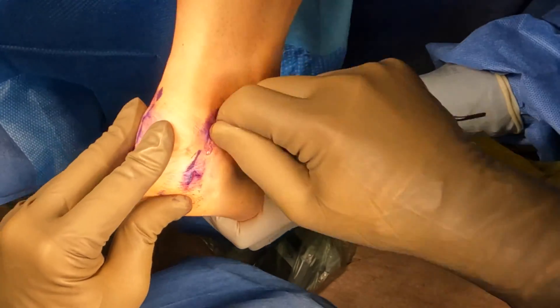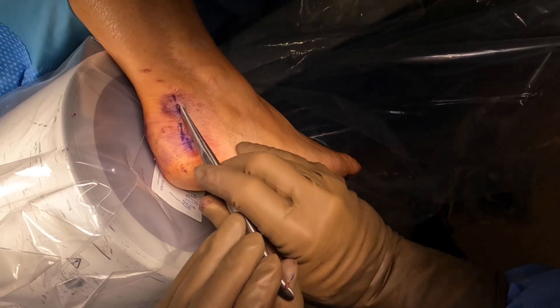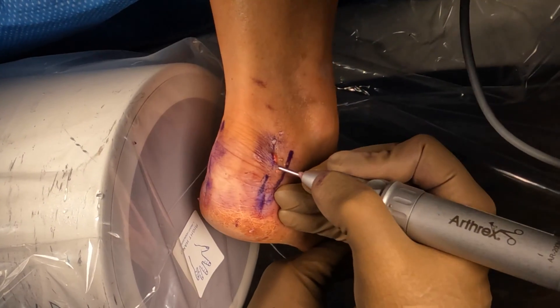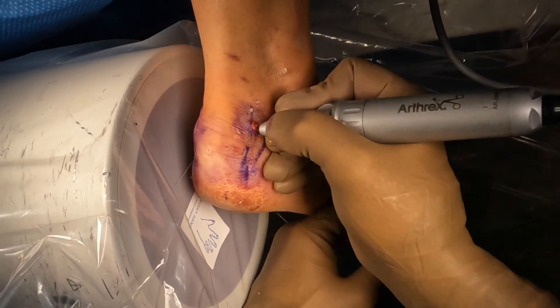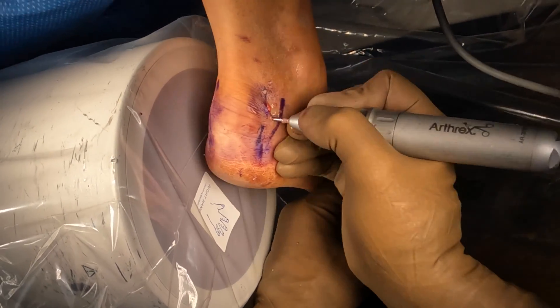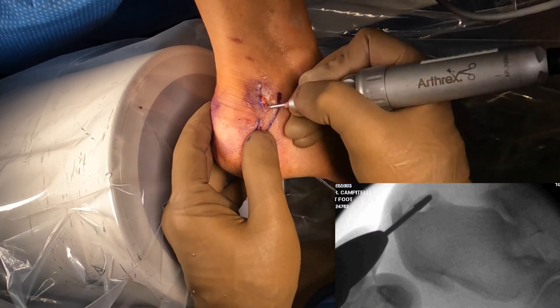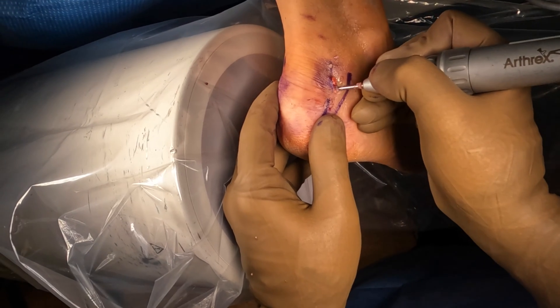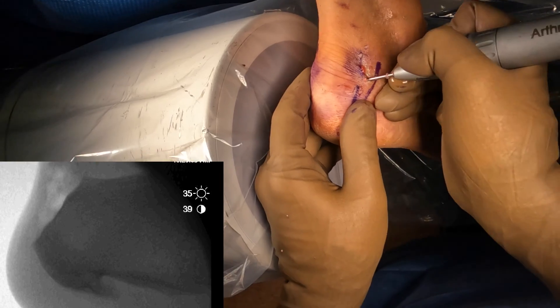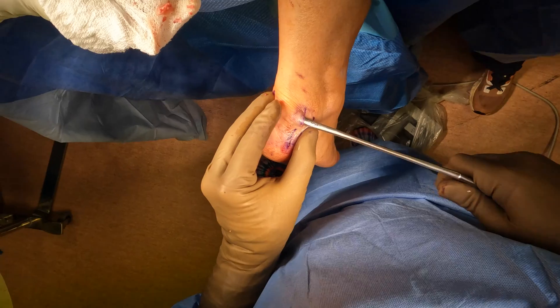What you can see we're doing here is separating the Achilles tendon from the calcifications that are on the back of the heel. We're using intraoperative fluoroscopy, which is x-ray, to allow us to see this bump so we know exactly where we're working. The analogy would be something like doing arthroscopic surgery in the knee or ankle, or even laparoscopic surgery in the abdomen. That's that large bump that we're removing with this burr — a high-torque, low-speed burr, so it's not actually destroying tissue. And you can see we've removed the back portion of the heel bone.